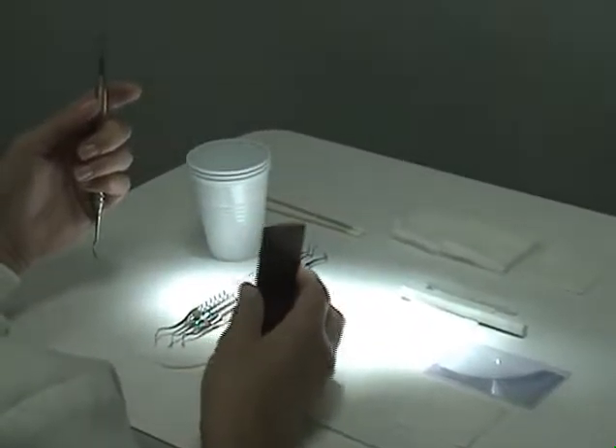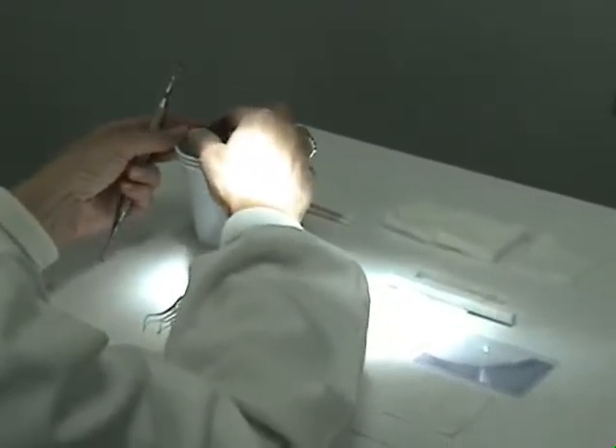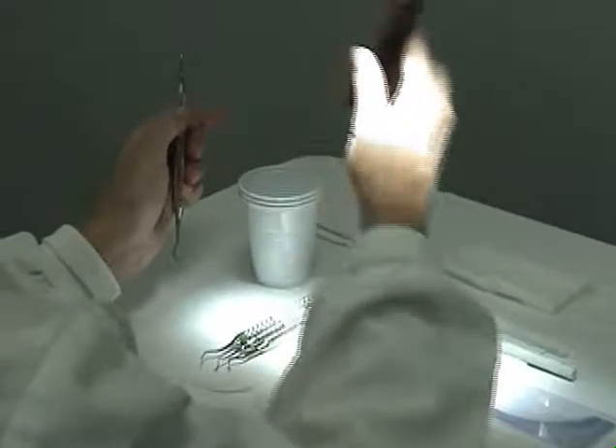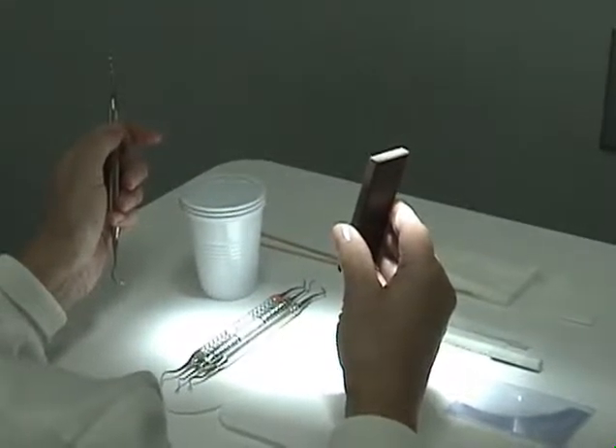Prepare the stone by placing it in a cup of water. Remove the stone and hold it with your dominant hand, grasping the lower half with your thumb towards you and your fingers away.